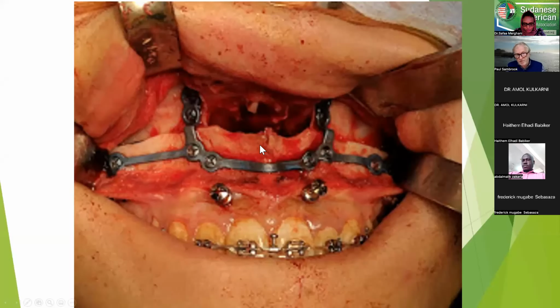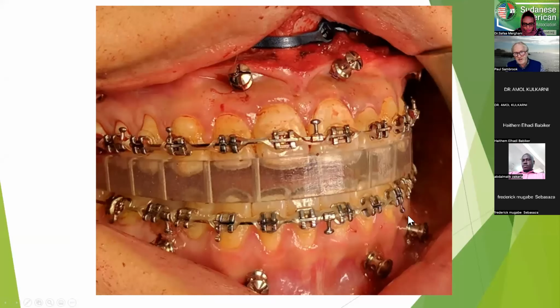And again, when we first started, we looked at using intermediate wafers and intermaxillary fixation to check really what we were doing. We've now done away with intermediate wafers. We have done away with intermaxillary fixation and rely 100% on the position of the final positioning plate. Again, as experienced surgeons, that's fine. But as inexperienced surgeons, you need to have a backup plan should something go wrong.